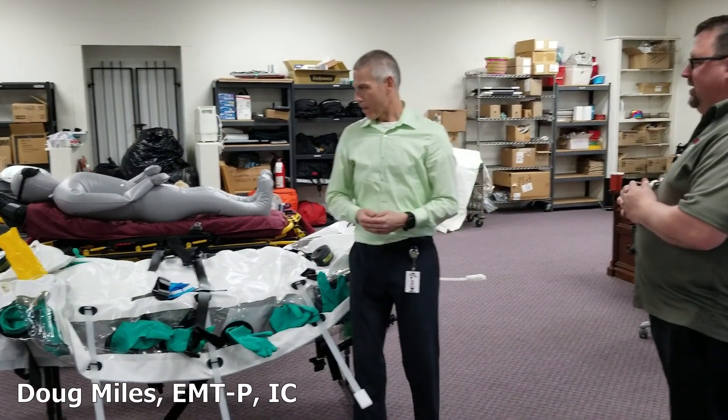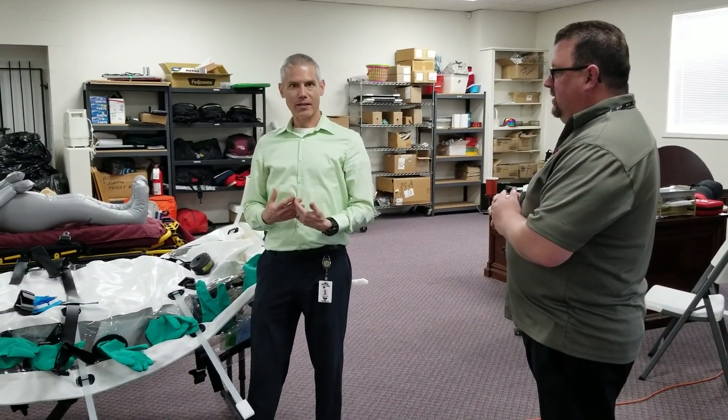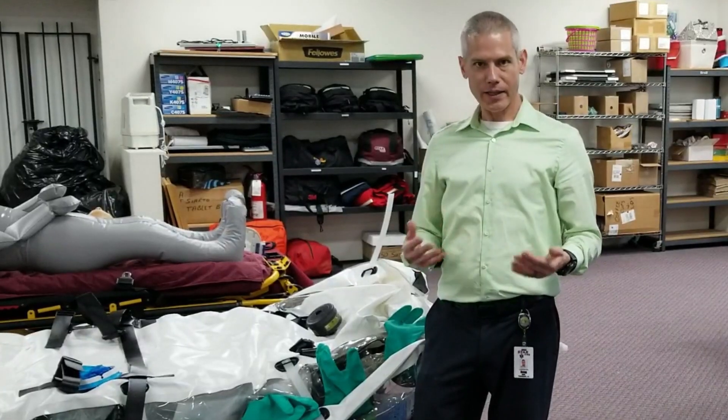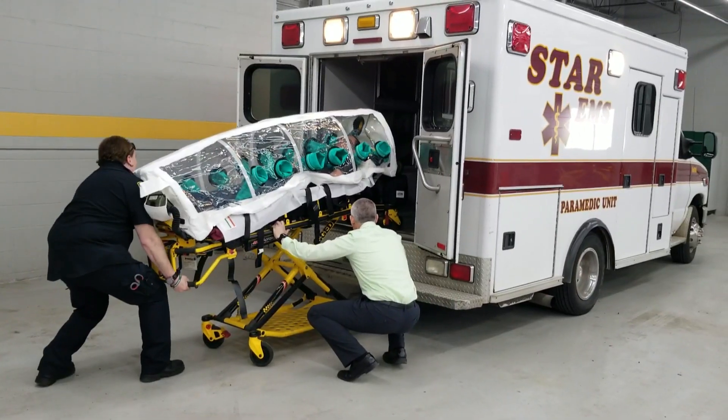We are training under the Special Pathogens Response Network guidelines that the state of Michigan has developed to transport safely a patient who has a highly infectious disease, such as the Ebola virus.